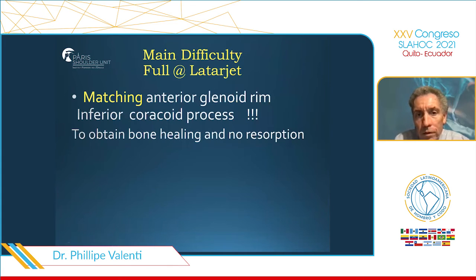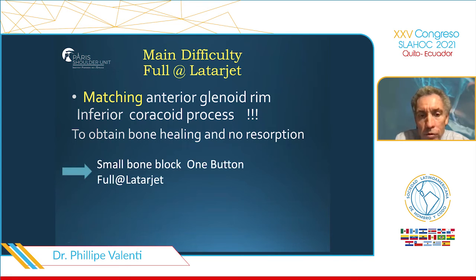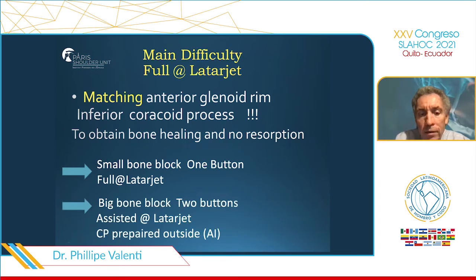The difficulty of the full arthroscopic Latarjet is to match the anterior glenoid rim to the inferior coracoid process to obtain good healing and no resorption. If I use a small bone block on one button, I do a full arthroscopic Latarjet. If I have to use a big bone block with two buttons, I pull the coracoid process outside the skin, and I prepare it outside the skin to obtain a perfectly flat inferior part of the coracoid process and use two buttons.